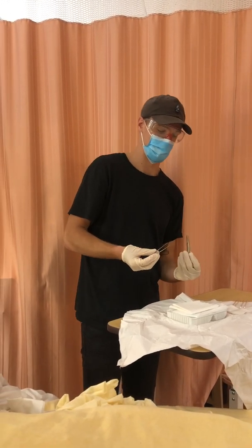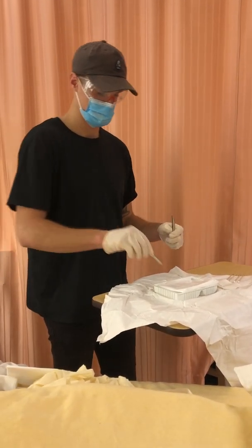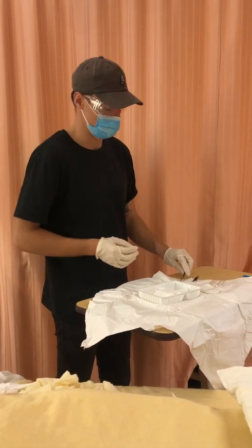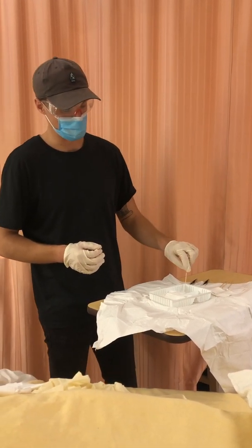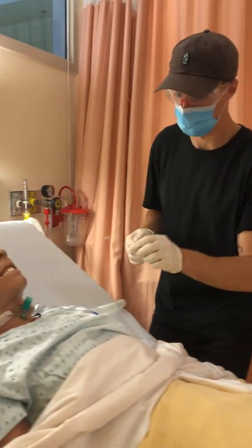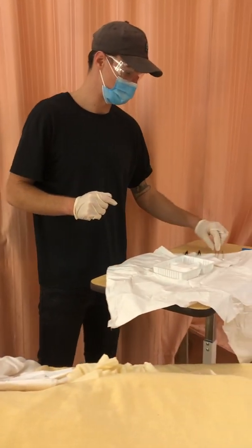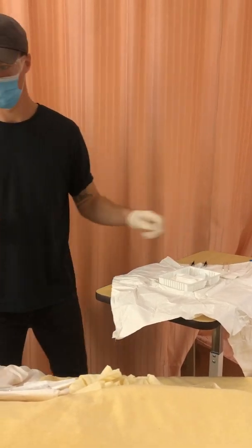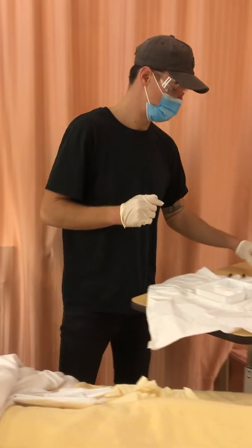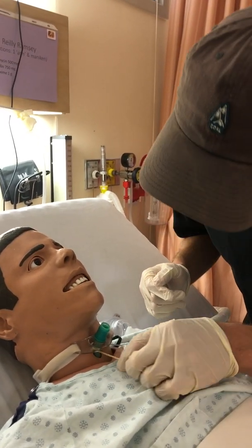I would grab a new pair of forceps because those are contaminated, but for the sake of the demo, I'm just going to keep going here. So I'm not going to use this, or this. And to start, I'm just going to use these cotton tip applicators and a moistened normal saline. I don't have normal saline in my tray right now, but in practice I would. Make sure it's kind of dried off there. Then I do one swipe on the bottom. Take another one, put it on the saline, go to the side over here into the top, drop, take a third one, normal saline, this side, and then to the top.